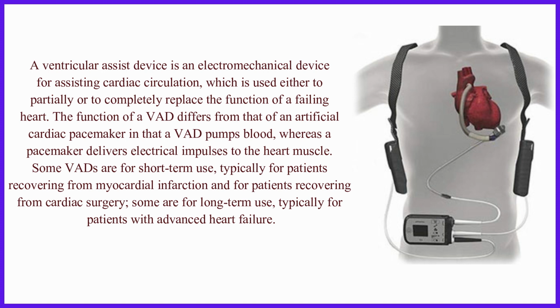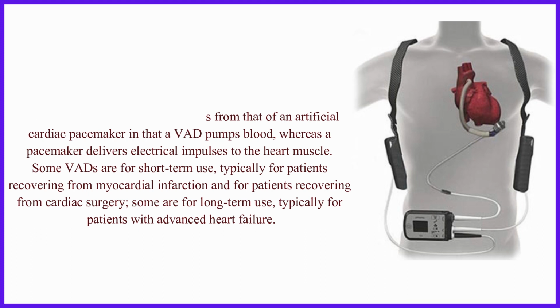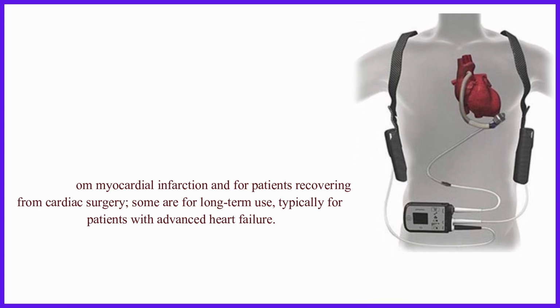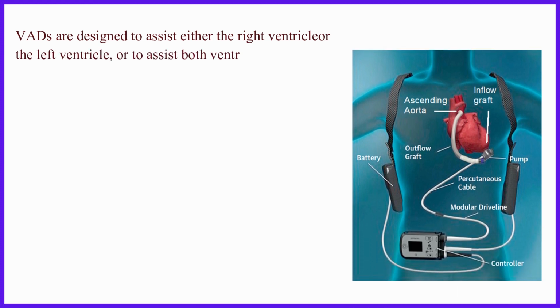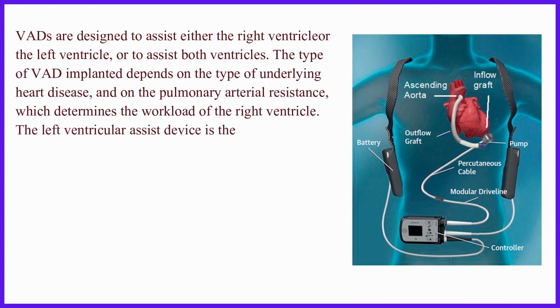Some VADs are for short-term use, typically for patients recovering from myocardial infarction and for patients recovering from cardiac surgery. Some are for long-term use, typically for patients with advanced heart failure. VADs are designed to assist either the right ventricle or the left ventricle, or to assist both ventricles.